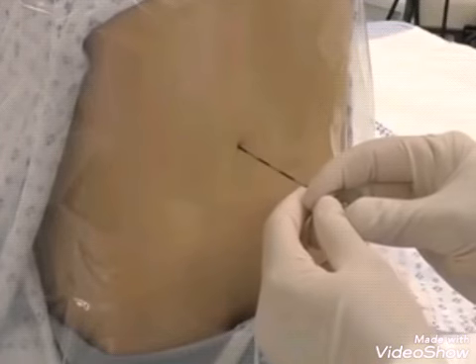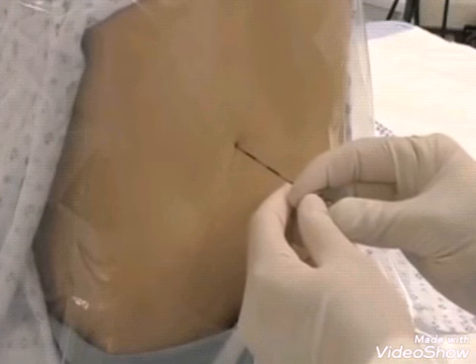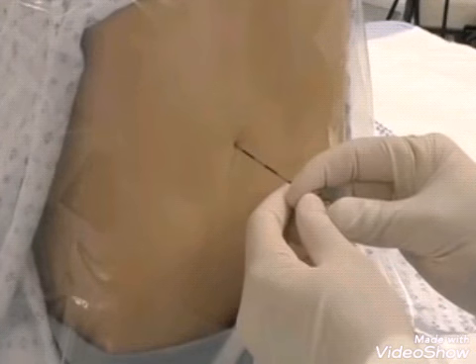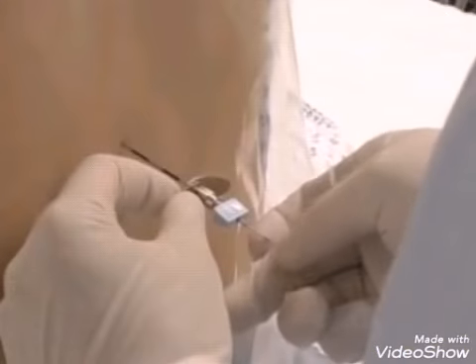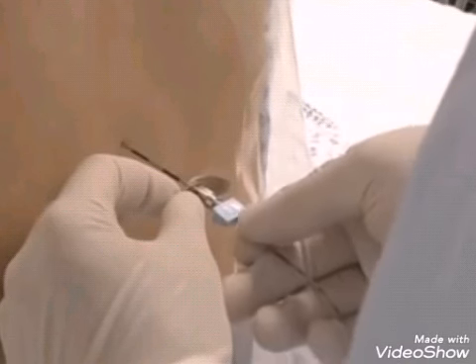Placement of a lumbar epidural catheter is performed to facilitate the induction of anesthesia and analgesia. This video presents the indications for and contraindications to the placement of a lumbar epidural catheter, the necessary materials and equipment, the relevant anatomy, and placement technique.